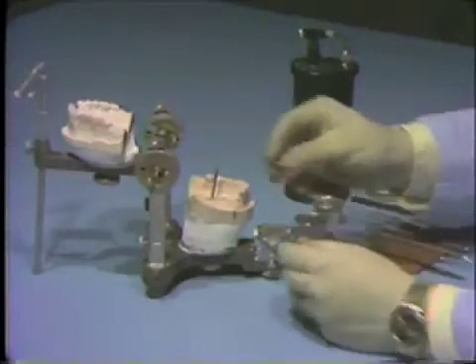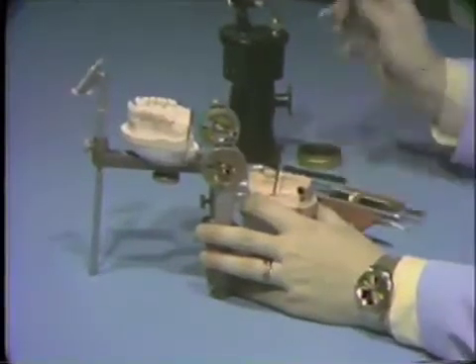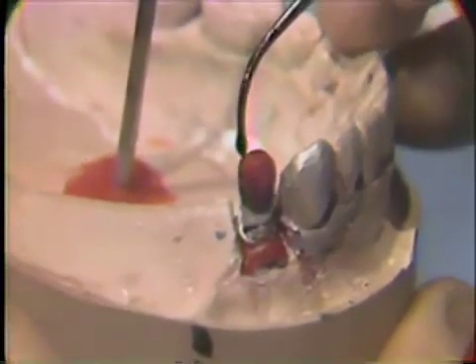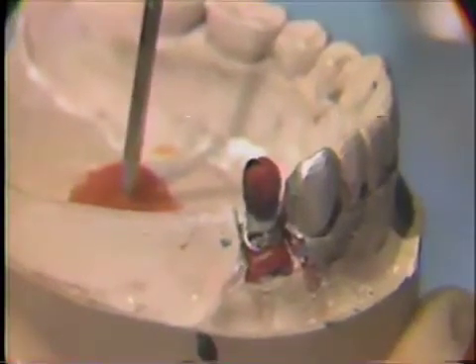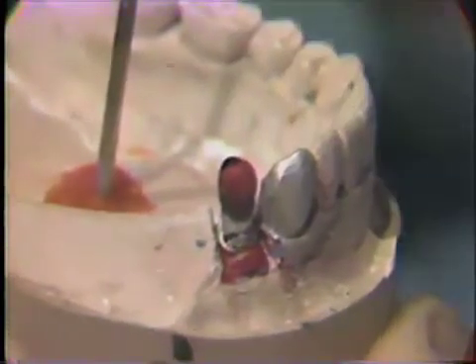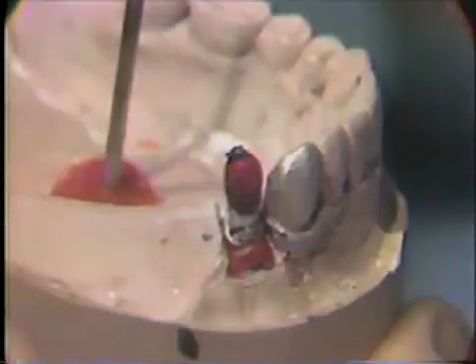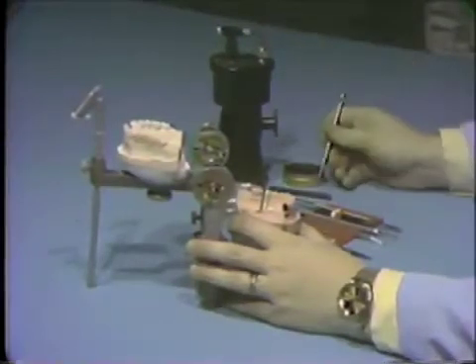Replace the die and coping on the cast on the articulator so you can build up the occlusion of the crown wax up by adding small additions of hard blue inlay casting wax. As you add the wax, close the articulator to secure the centric stops. Repeat the procedure until you have accurately defined the centric stops of the crown wax up in the blue inlay wax.